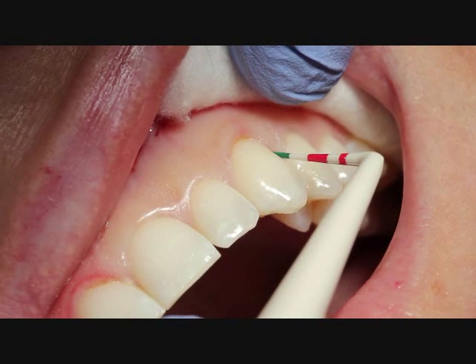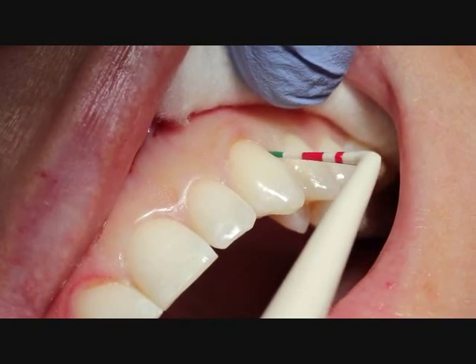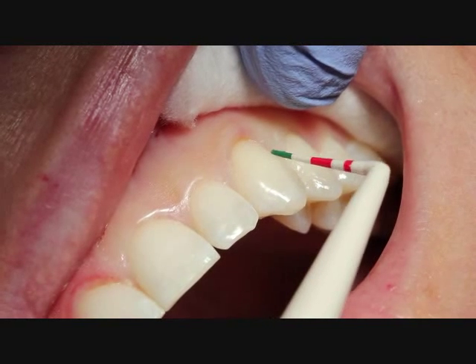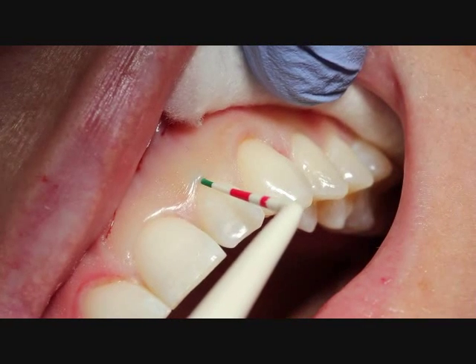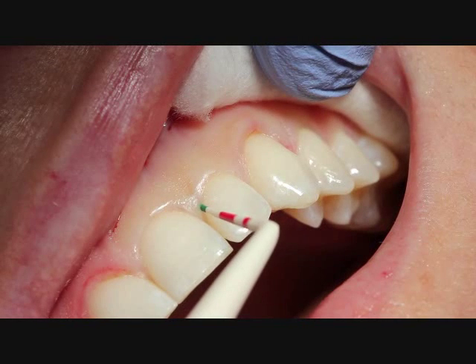In this clinical video, we're going to be using the LTM Precise Laser to do a little gingivectomy procedure. The patient is not happy with the length of her teeth, so we're going to go around and probe. Her gum tissue is very healthy. There's plenty of attached gingival tissue, and as we probe, we just have 2 to 3 millimeters.